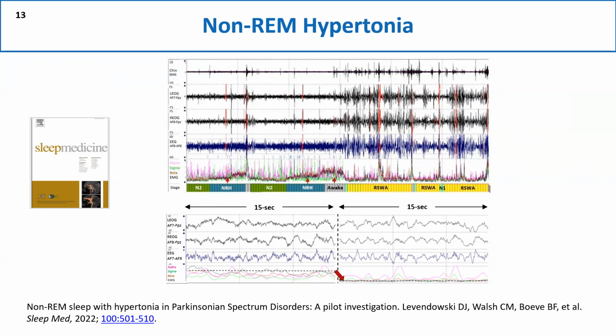When we zoom out, here we're looking at a 1-hour time window. This is how we discovered the characteristic, because the EMG power was going along, and then all of a sudden it elevated and stayed quite consistent. Here it elevated again, then there's an awakening and it drops back down. And here it goes through the pattern again.